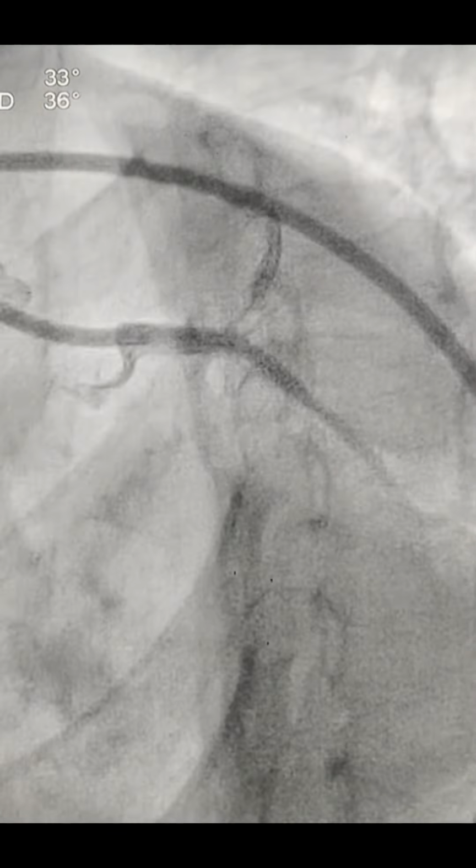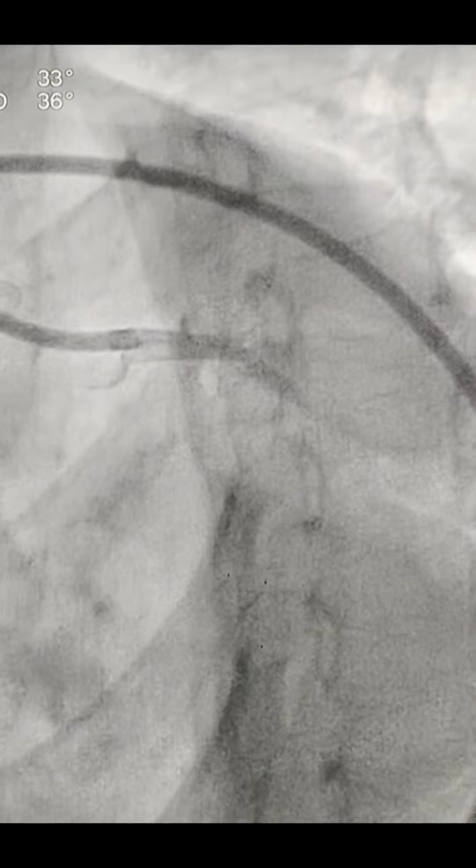So this was a 48-year-old female, known case of diabetes and hypertension, who presented with an evolved anterior wall ST elevation MI. After 4 days, she presented. So this was an angiography, and you can see there is an ostial LAD significant lesion, a thrombotic lesion. So we decided to do the IVUS guided angioplasty to the LAD.